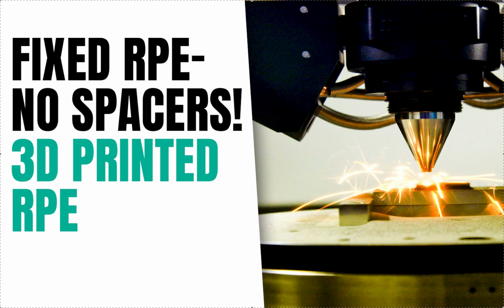I'm excited to update you guys on the next few videos for some new expansion devices that are out there. For many, many years, our only options were fixed banded expanders where you have to drop a spacer in first. When I was doing it, we dropped the spacer in first, then they'd come in and fit bands. It was a multi-step process. Then they'd come back and get spacers before delivery, and then we'd deliver it. So it was either a 3 or a 4 appointment process. What a pain. And spacers are totally nasty. They're just uncomfortable, they're annoying, they're old school.